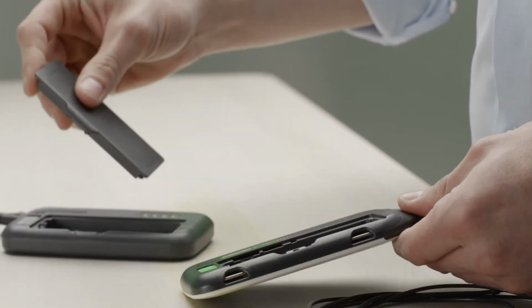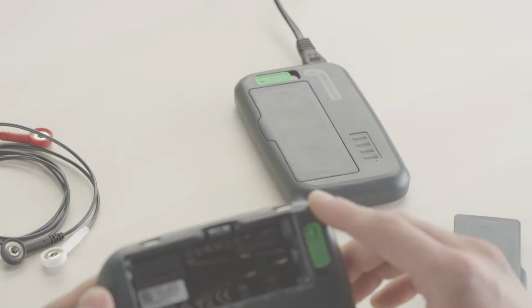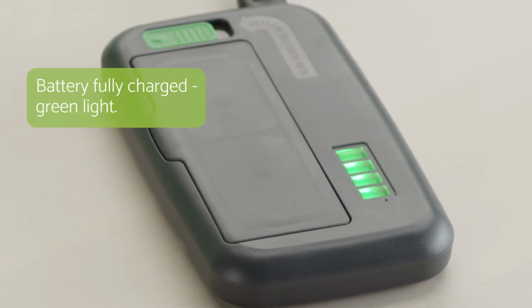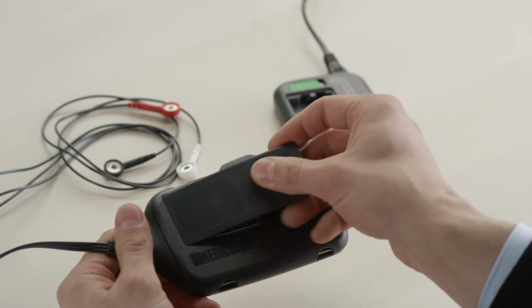While one battery is in the monitor, the other battery can be in the charging station. Take the battery out of the device. To charge it, plug the charger in and insert a battery. When the battery is fully charged, a green light will be visible on the charger. You may now remove the battery from the charger.